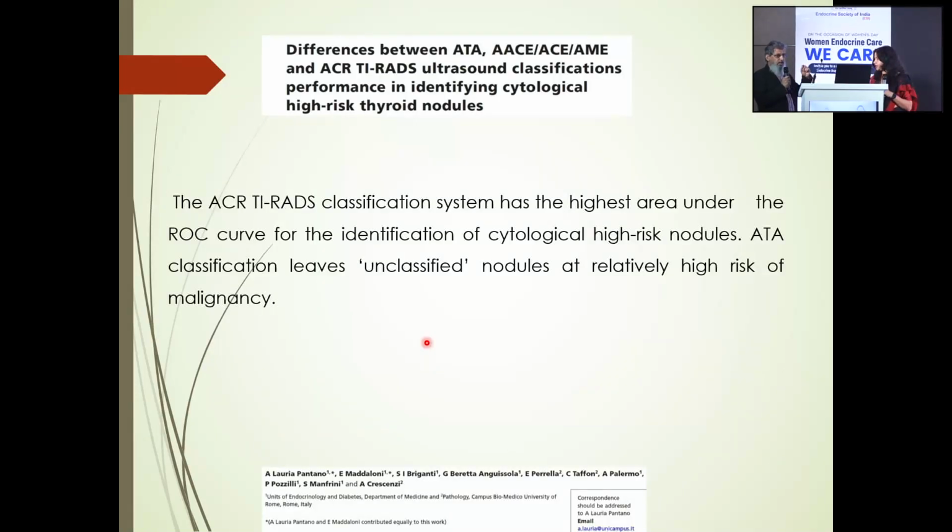For a complex nodule, I'll add one point: we aspirate the cystic portion first and do the FNAC from the solid portion separately. And the message is it's better to go for ultrasound guided. In my practice, I normally prefer that, because as we saw, they may pick up just the fluid and you may not actually get the tissue and you may not get the correct picture. So it's always a wise decision to do, and it avoids unnecessary pricks for the patient also.